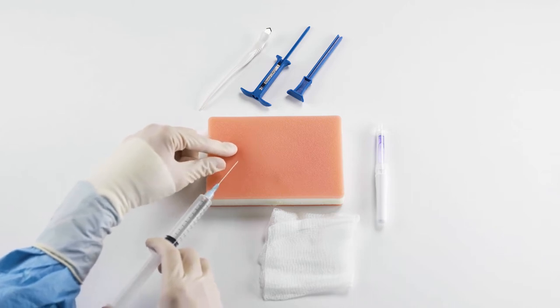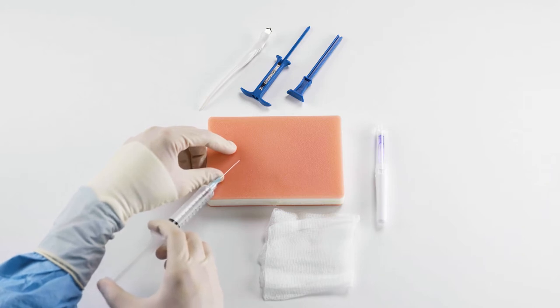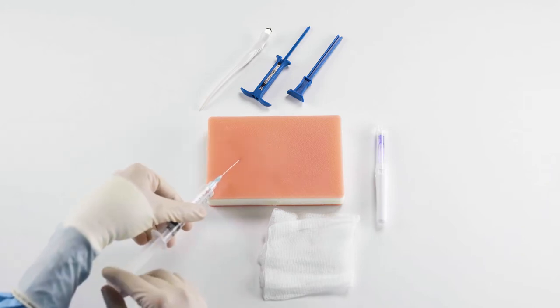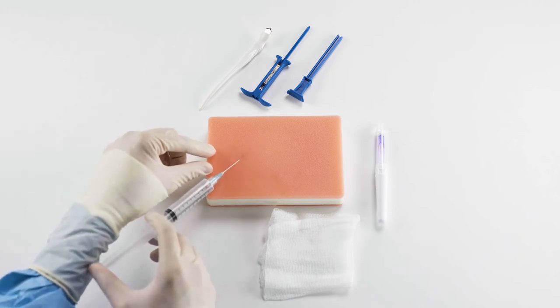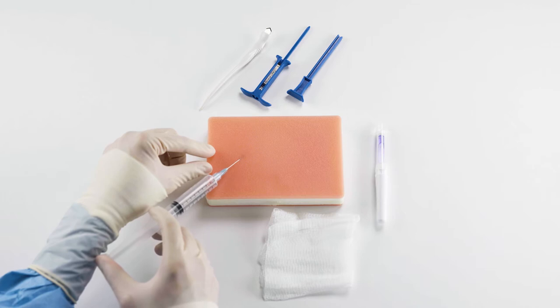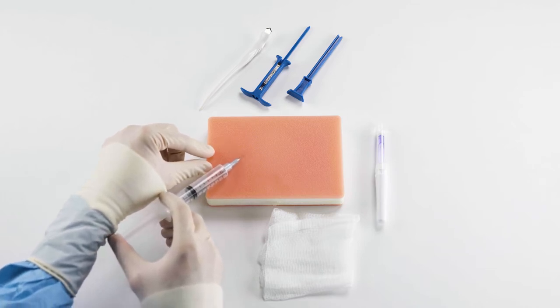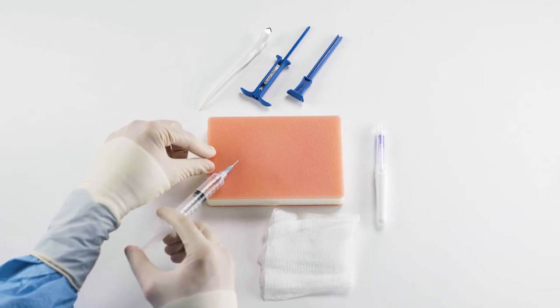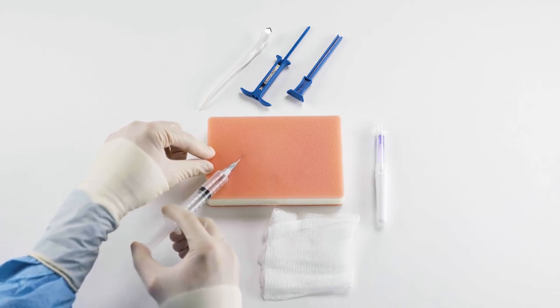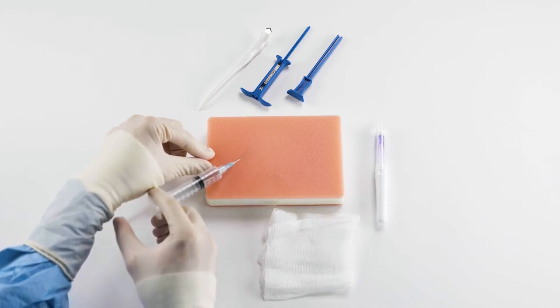I'm going to ask them to take a deep breath in, and as they're letting it out I'm going to puncture the skin. I'm going to aspirate to make sure I'm in no blood vessel and inject the lidocaine slowly, advancing my needle in that 45-degree angle. There's no reason to rush here — patients tolerate this better if you inject it slowly. I'm going to cover a couple of degrees above and below that 45 degrees in case the ICM is deployed slightly off angle, so the patient will still be comfortable.